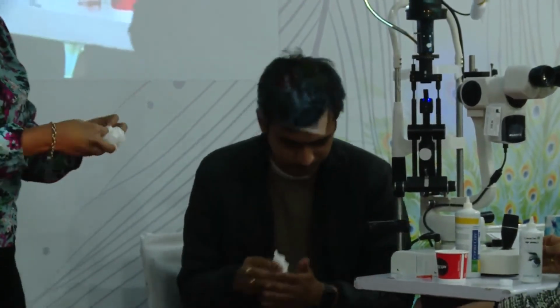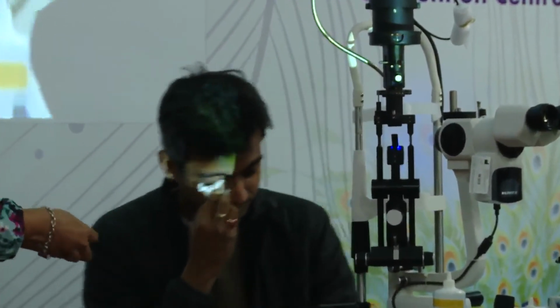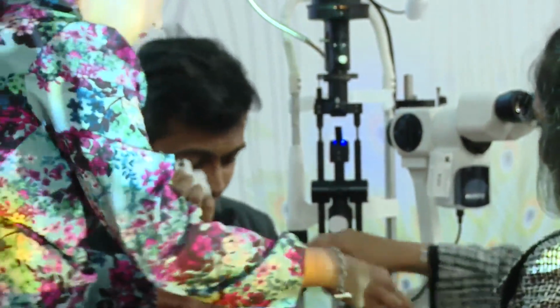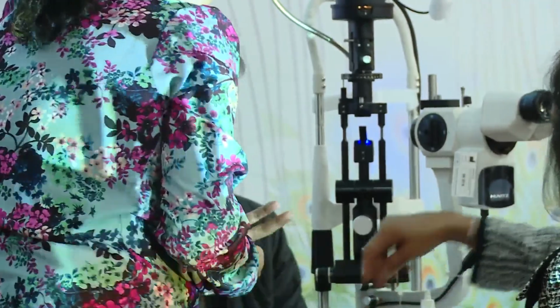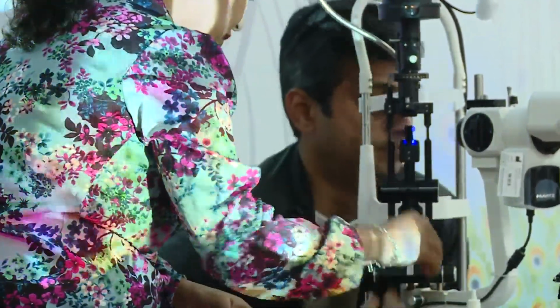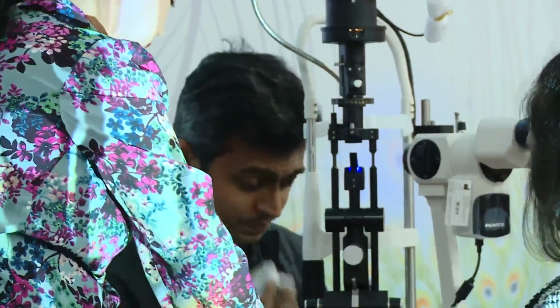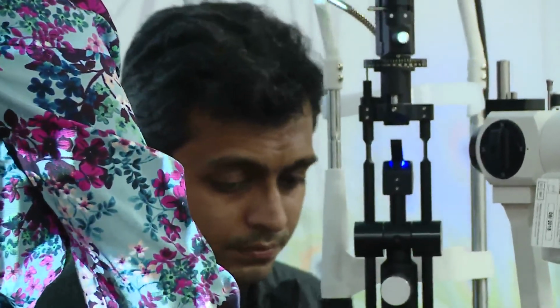So the head has to be exactly parallel to the floor, and that is very important if you don't want bubbles inside. That's the only technique in sclerals which is important. It can't be at any angle. It has to be straight, parallel to the floor. So it just caps over the eye very easily.